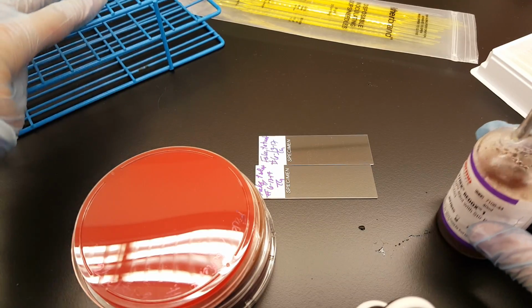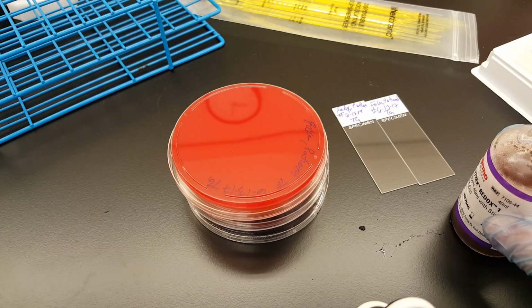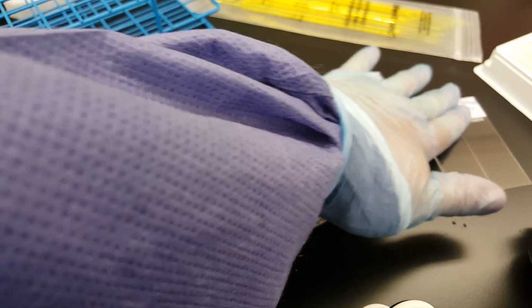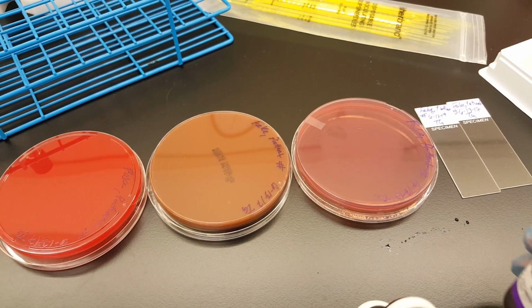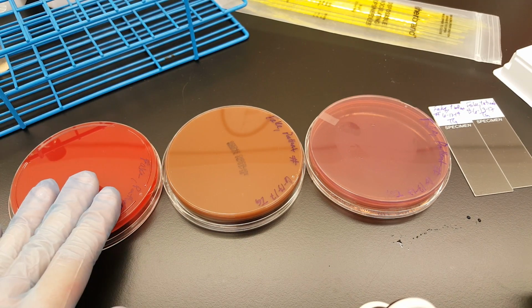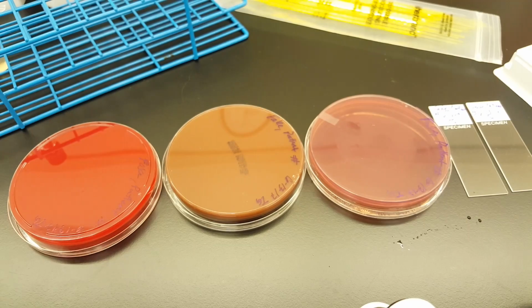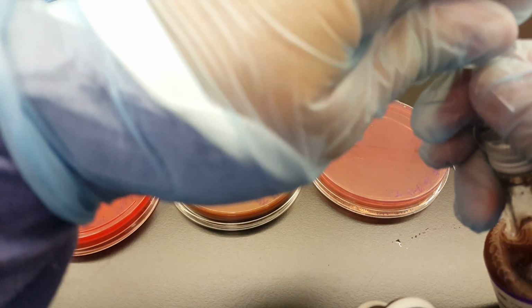And so what we're going to do now is put a drop in the first quadrant of each plate, and then we inoculate it out afterward, okay? So keeping with what we've said before, you do the blood, then the chocolate, then the McConkey, and then your 2 gram stain slides. You're going to leave them out like that.